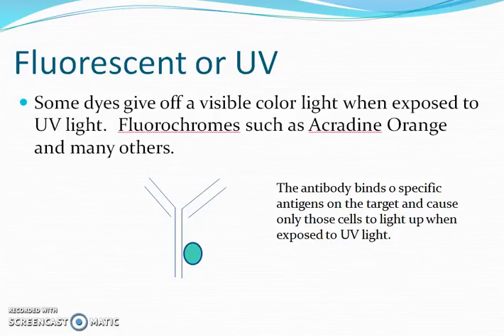Okay, wait a minute. If I isolate a bacteria from the environment, I have to streak it out, wait 18 to 24 hours for it to grow, maybe streak it on another media in order to run some biochemical tests. So it may be days before I can identify it using older methods of isolation and identification. This can give a doctor an almost immediate diagnosis of the causative agent of a disease.